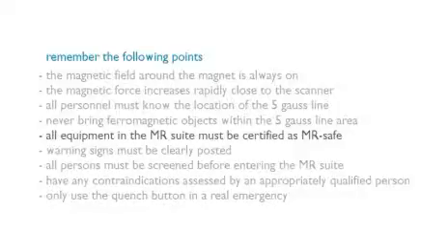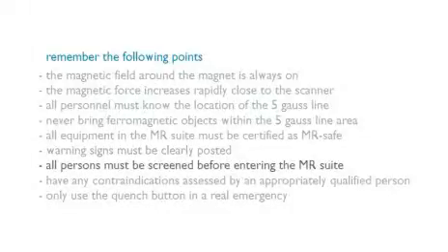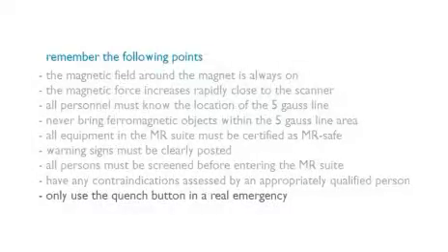All equipment in the MR suite must be certified as MR safe. Warning signs must be clearly posted. All persons must be screened before entering the MR suite. Have any contraindications assessed by an appropriately qualified person. Only use the quench button in a real emergency.